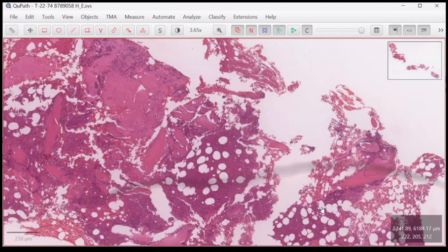So 1 month, they have completed, the marrow should have been fully recovered. Meaning you can get the normal cellular marrow with fat spaces, and then you get erythropoiesis, granulopoiesis, and lastly the presence of megakaryocytes. So we have to look at those features if there is evidence here in this marrow.